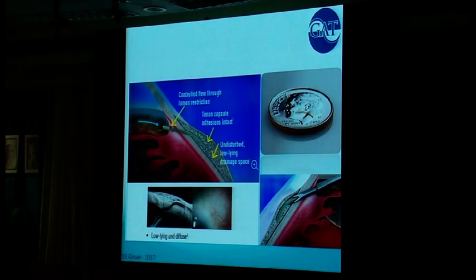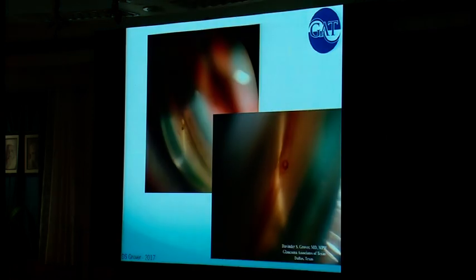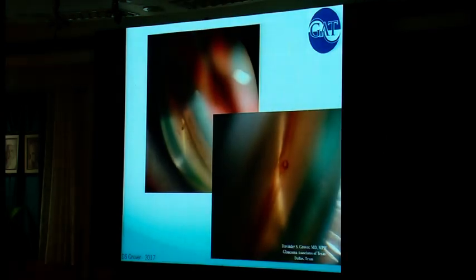It's small. Ideally, this is the company picture, but I don't think it should go through Schlemm's canal. I think it needs to be anterior to that. If you go through Schlemm's canal, you're going to get blood reflux. So that's not where I place them, ideally. In some of these videos you will, but you try to go a little bit anterior to Schlemm's as the target. There are 3 lumens with this implant, 140, 63 or 65, and 45.